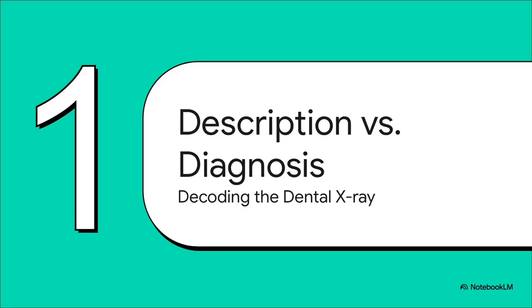So let's get one thing straight right off the bat. This isn't about learning how to diagnose problems. Nope, this is about learning the language of description. This is the universal terminology that lets a hygienist in one office communicate perfectly with a dentist in another just by describing what an image looks like.